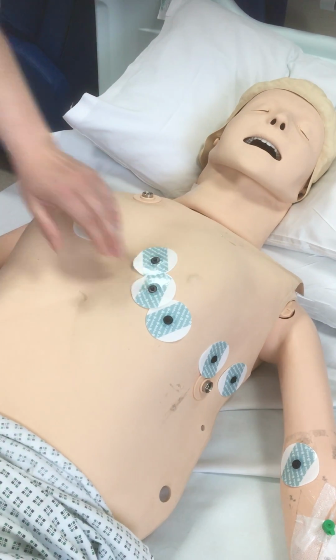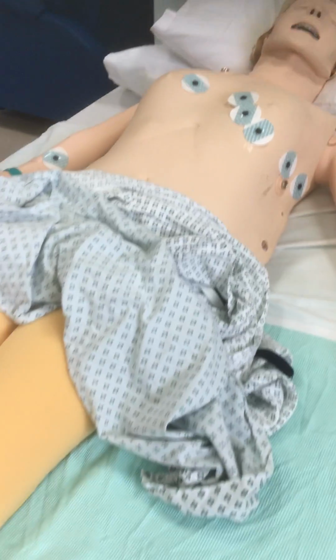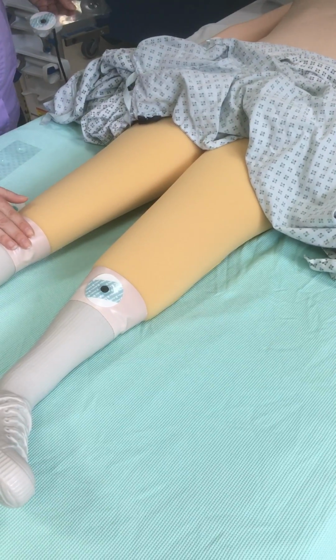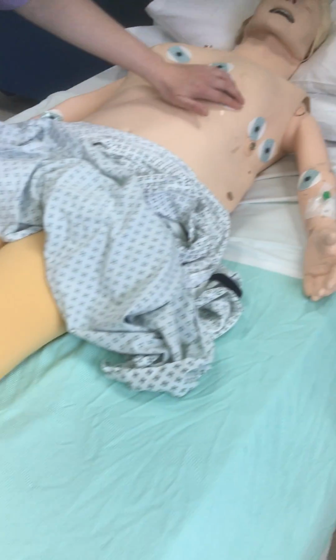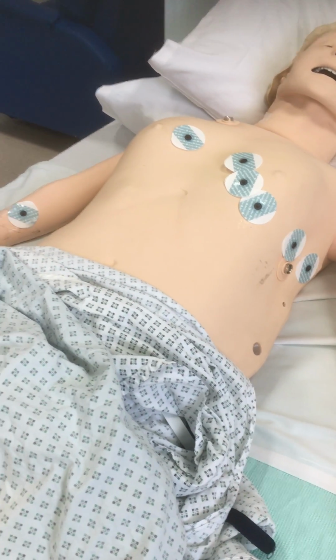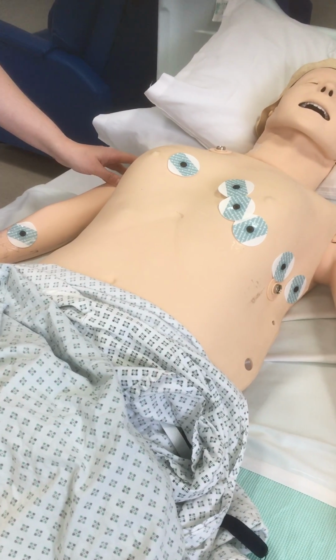There we go. And your limb leads, you want to try and put your limb leads as low down on the limbs as you can, depending on scar tissue. Again, avoid scar tissue because you won't be able to get a very good reading. The same goes for the chest. And the arms, again, low down if you can. However, if the patient has a tremor, it's better off higher up the arms.